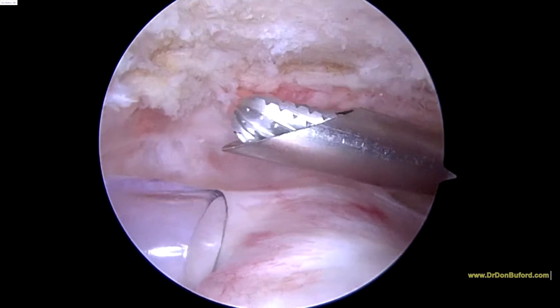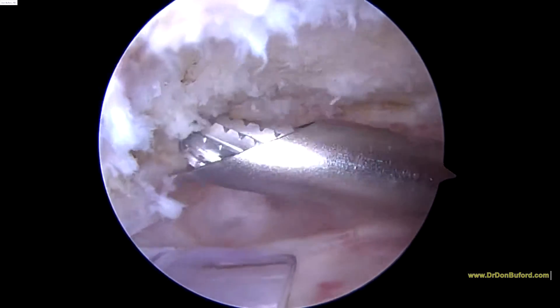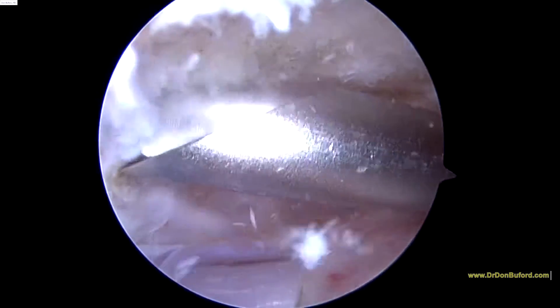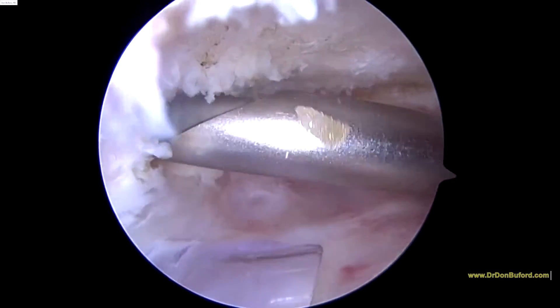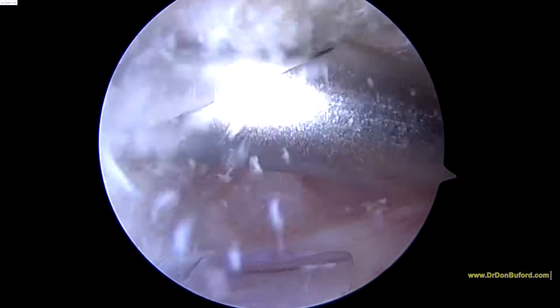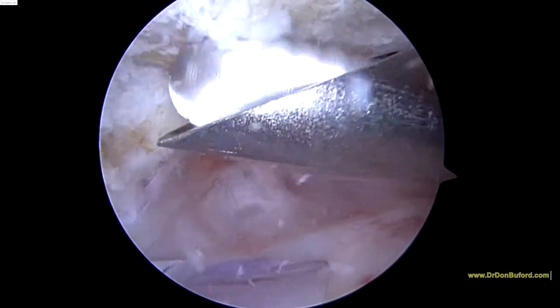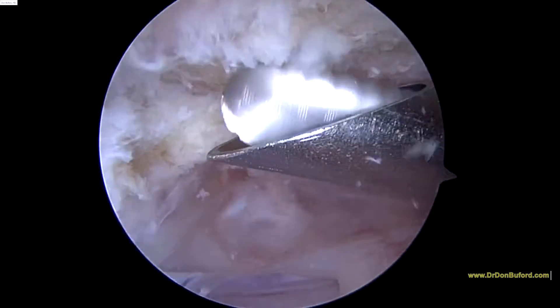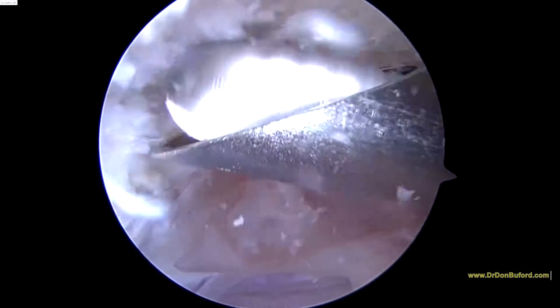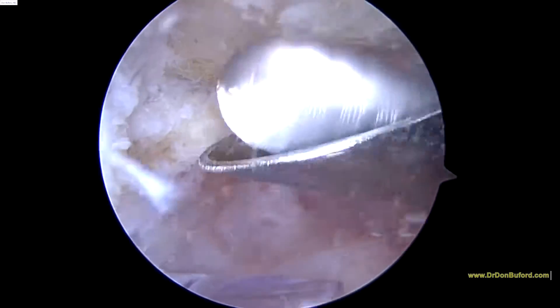Now we're looking in the subacromial space. This is a burr coming in from the back of your shoulder to the right, the front of your shoulder to the left. A little bit of bone hanging down here — we're just going to start the burr and take off a little bit of this anterior lip just to level out the acromion. This is the bone that makes up the roof of the shoulder. Okay, so that looks nice and level.